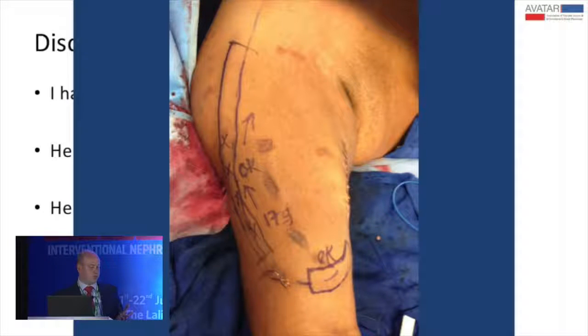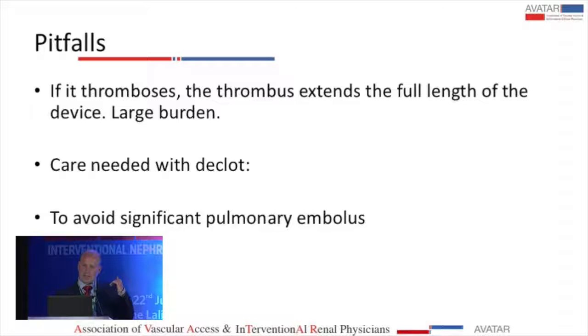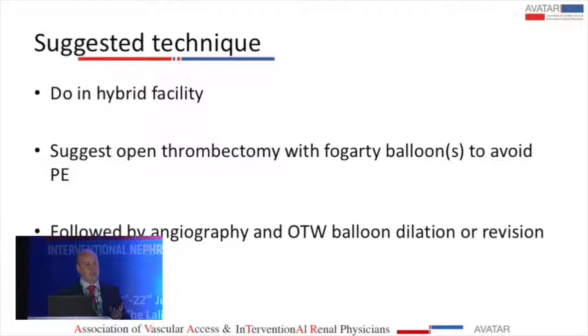He tells me that the most common thing that causes a problem is the coupler moving, kinking, and that may need open surgery and tacking down to straighten it out. The other thing he's described is cannulation areas, bits of the graft being disrupted inwards, and those can be pushed back up. But the next recommendation is, if you can't salvage it, to explant the vascular outflow component, because it's associated with significant thrombus burden at the tip, which can cause recurrent pulmonary embolus. And he says to overwire it and replace it with a tunneled line once you explant it.